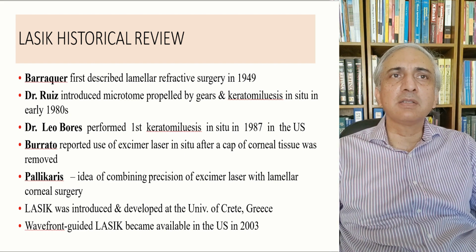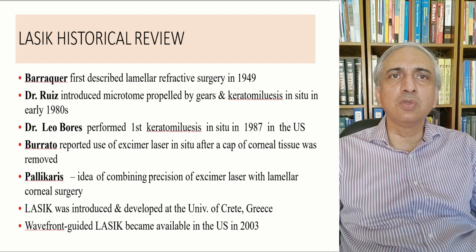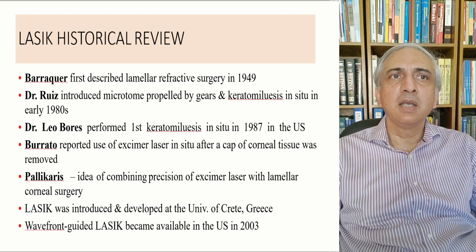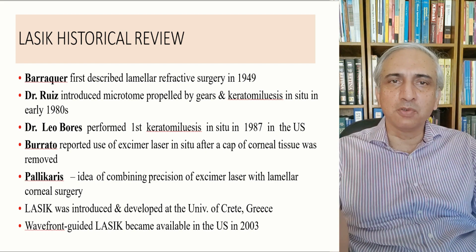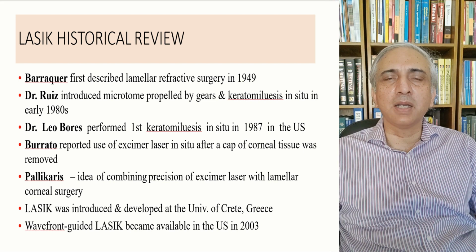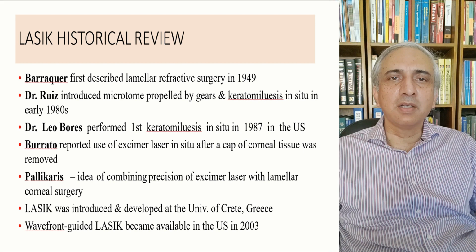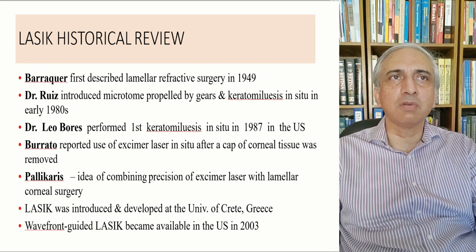And Palikares' idea of combining the precision of excimer lasers with lamellar corneal surgery. LASIK was introduced and developed at the University of Crete in Greece by Palikares, and wavefront-guided LASIK became available in the US in 2003 after it was approved by the FDA. Usually these lasers tend to get approved more quickly in the European countries compared to the USA, where the FDA has very strict regulations.